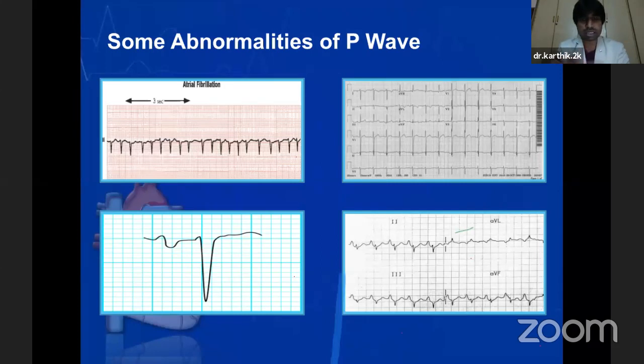Suppose the patient has biatrial enlargement, there is a particular morphology of the P wave. If there is right atrial enlargement, there is a morphology for a P wave. So these are the illustrations which will demonstrate that to you. In the first figure, we can see that there is an absence of P wave. In the second illustration, on the right top corner, we can see that the P waves are normal. In the third illustration, on the left bottom corner, we can see that the P wave is biphasic.